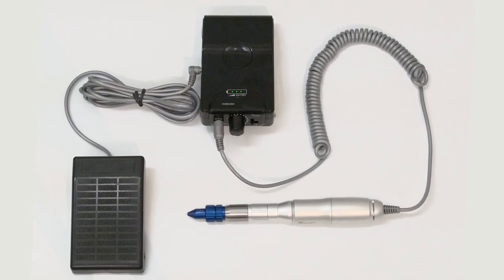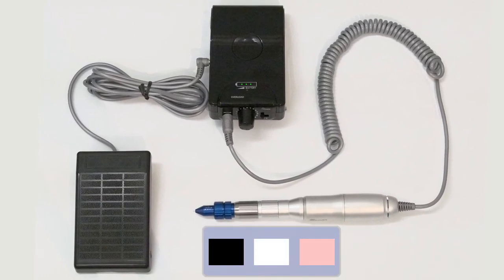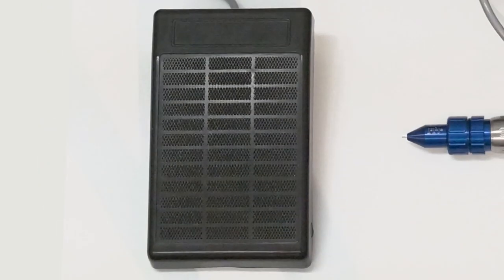The Vortex comes available in three colors: black, white, and pink. It also includes a foot pedal and waist pouch for your convenience.